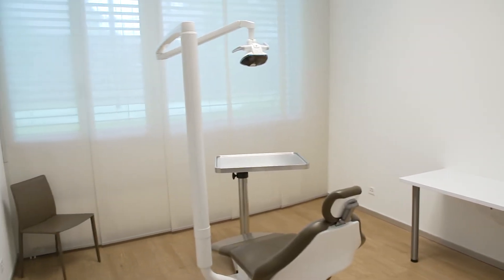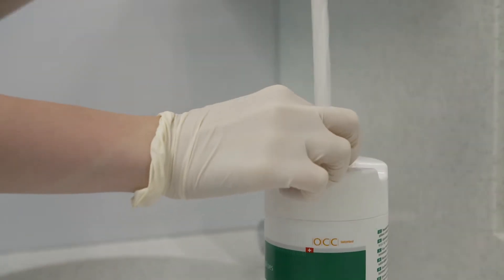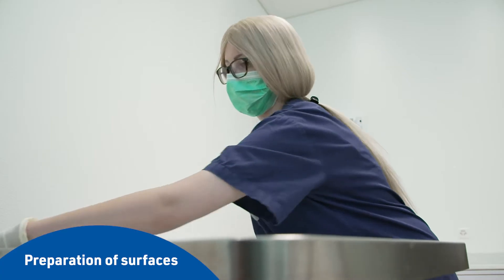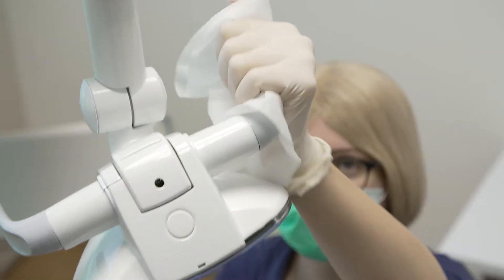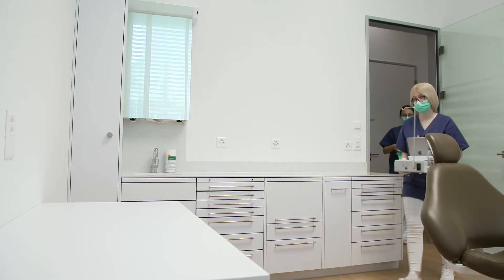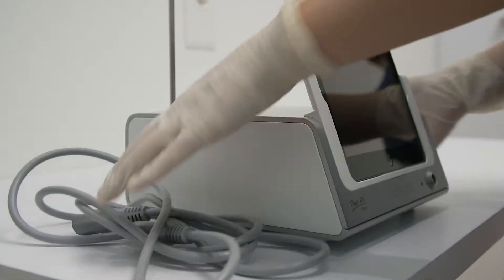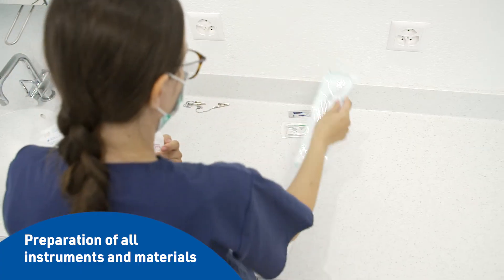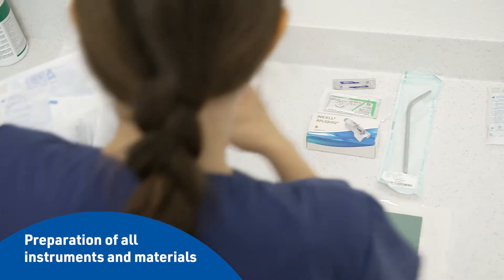Aseptic technique provides the basis for good wound healing, surgical success, and patient health. It should be considered the standard in implant surgery. Basic principles include surgical hand disinfection and the use of barriers, careful preparation of surfaces, instruments, and the patient, and control of the environment.